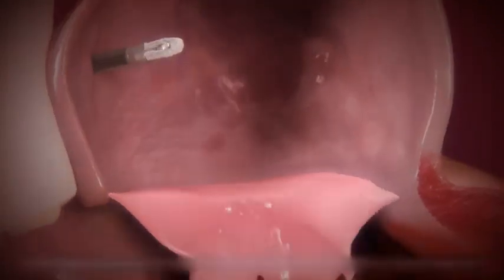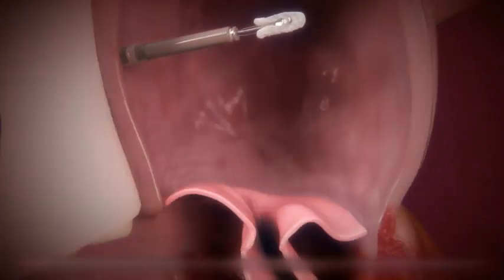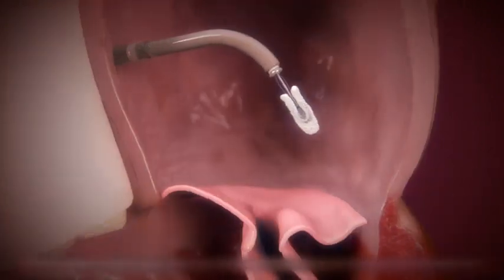The clip delivery system is advanced into the left atrium, positioning the clip above the regurgitant jet and perpendicular to the mitral valve plane.